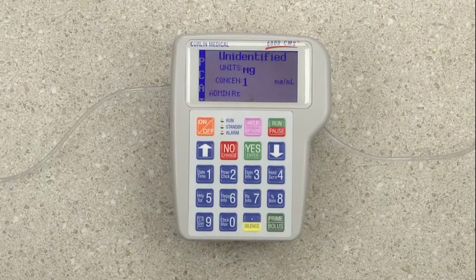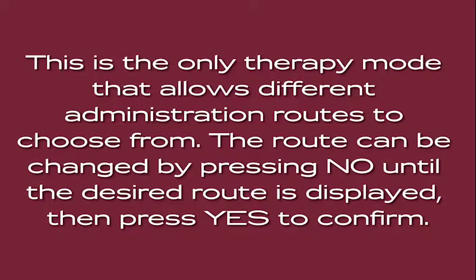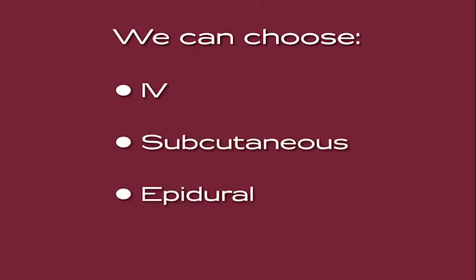Now we'll select the administration route. This is the only therapy mode that allows different administration routes to choose from. The route can be changed by pressing No until the desired route is displayed, then press Yes to confirm. We can choose IV, subcutaneous, or epidural routes.